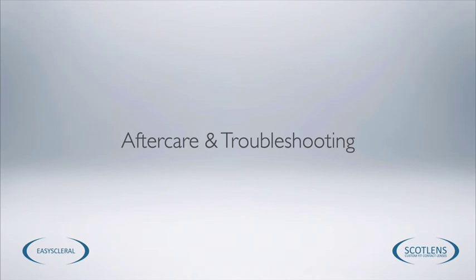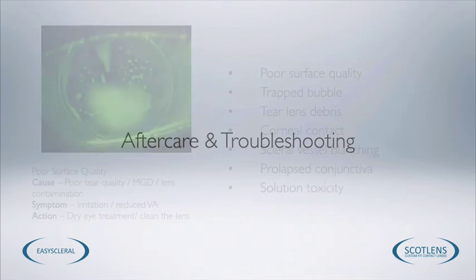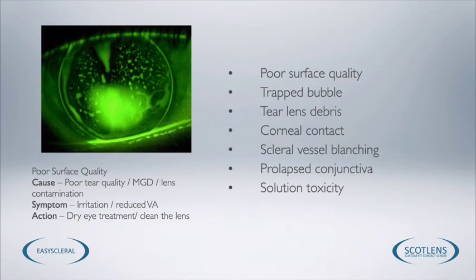We have some unusual aftercare issues that we don't see with normal contact lenses. Of course, all contact lenses suffer from dryness, and scleral lenses are not a fix for that. The outside surface of the contact lens can still dry. If this results in poor quality of vision or discomfort from the patient, you need to manage their dry eye in the same way that we would do normally.